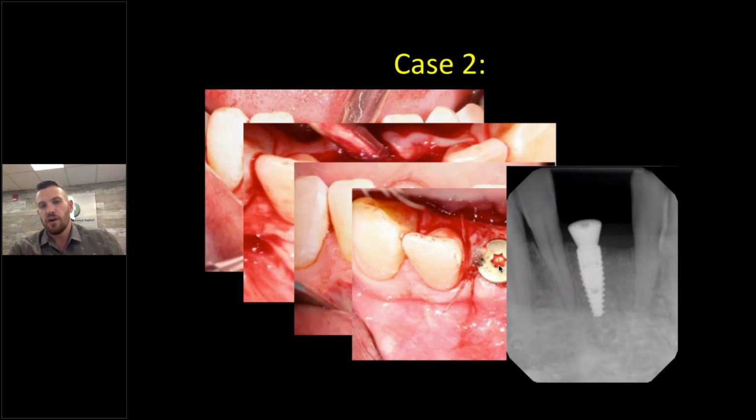And this is a picture of the x-ray before it was sent off to the general dentist. The implant was placed slightly in a different position, instead of the position it was in already, because the bone height was slightly higher on that side. So if you're wondering why I switched sides, that's why.